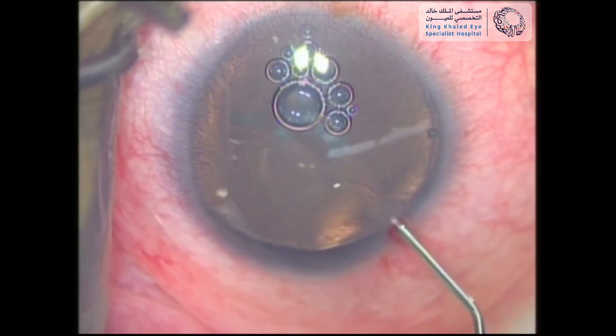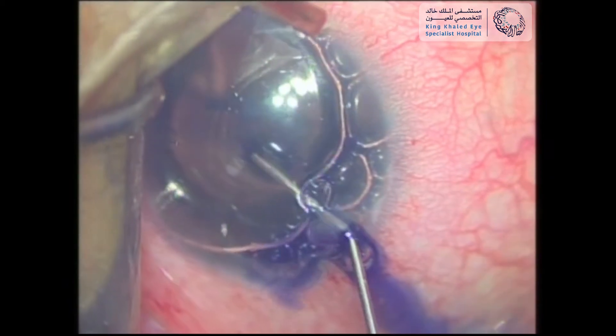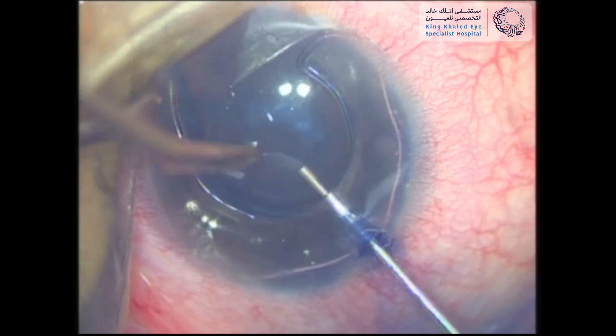The surgery was started by opening a side port. The anterior lens capsule was stained with trypan blue under an air bubble, as this will help enhance visualization. After that, the anterior chamber was inflated with the use of a cohesive viscoelastic agent.